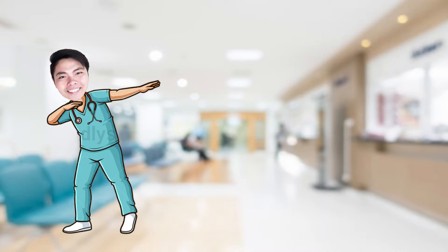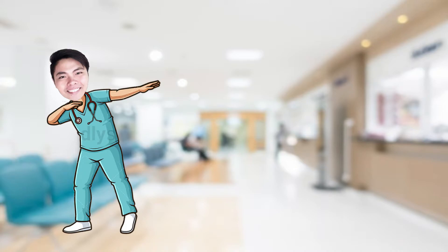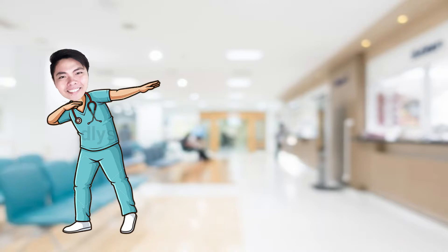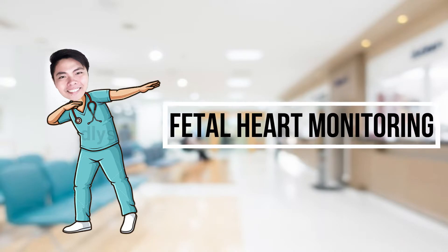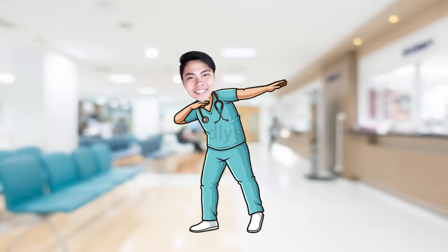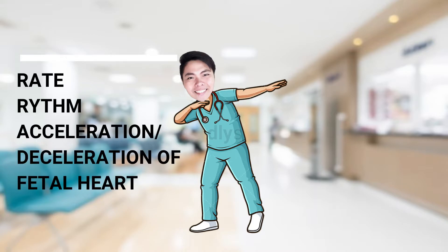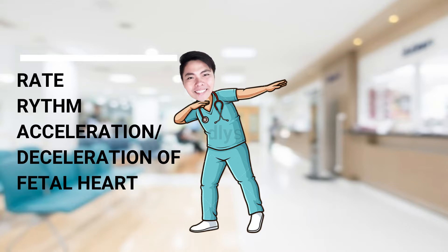Hi, good day everyone. I'm Renipro Paolo, a student nurse from West University Philippines. Today I'm going to teach you how to perform a fetal heart monitoring. The purpose of this procedure is to check for the rate, rhythm, and presence or absence of acceleration and deceleration of the fetal heartbeat.